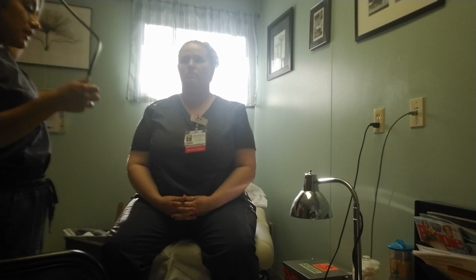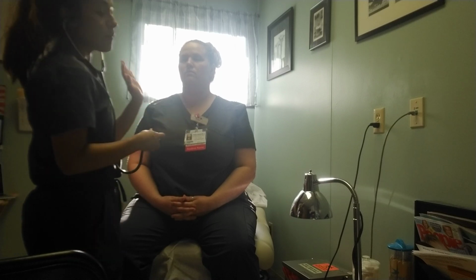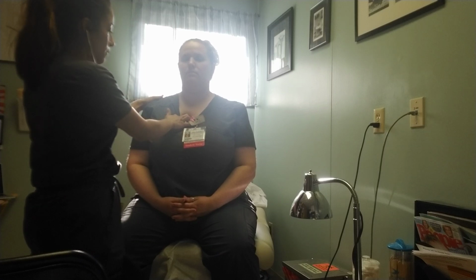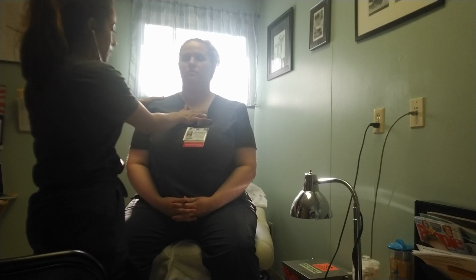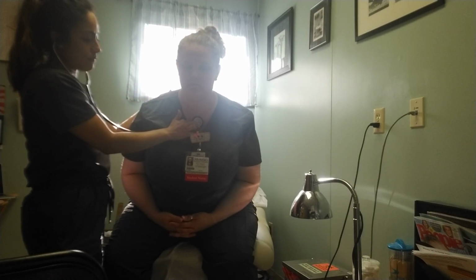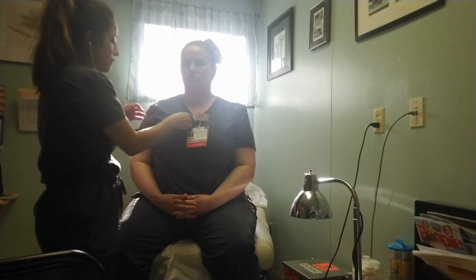And then I am going to listen to her heart now. Alrighty, we're going to start at S1 over here with the diaphragm. I'm just going to move your shirt to the side. Awesome. Perfect. And I'm actually going to have you lean forward for me.